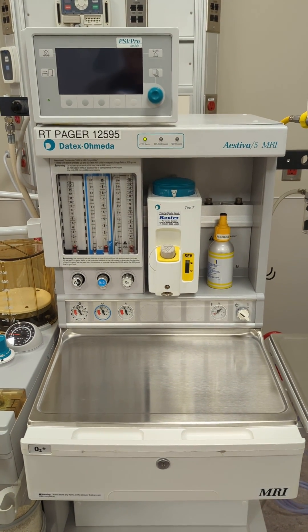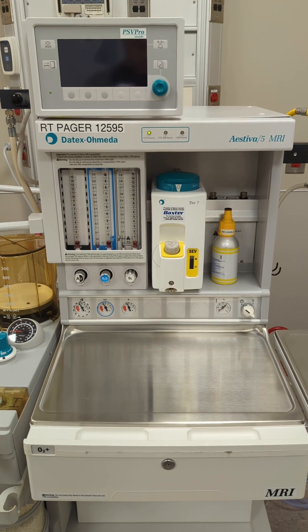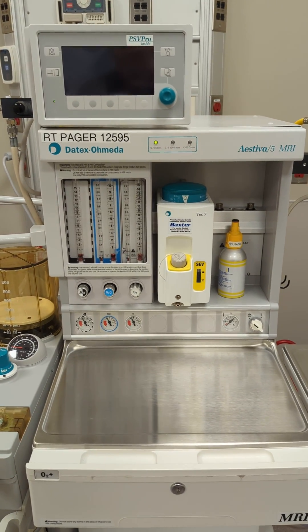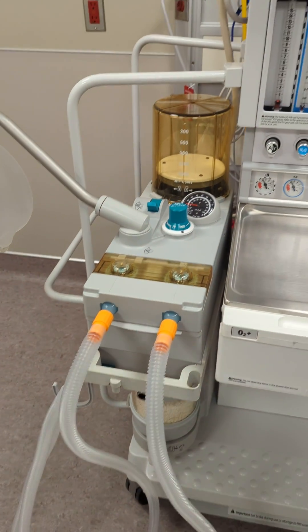Hello everybody, welcome to your Aestiva 5 MRI Anesthetic Gas Machine Pre-use Leak Tests. In these tests there are two: one to test the leaks in the vaporizer and one to test circuit leaks.